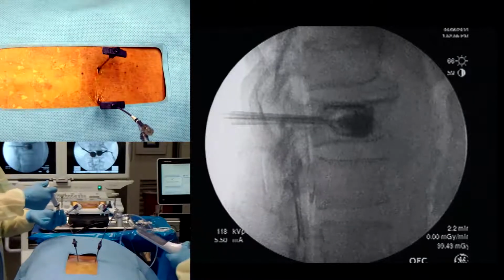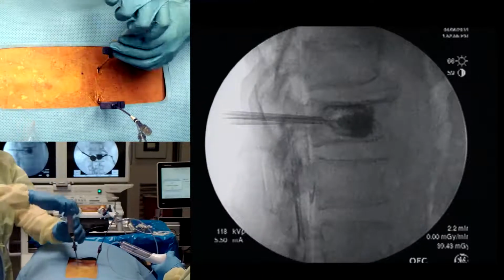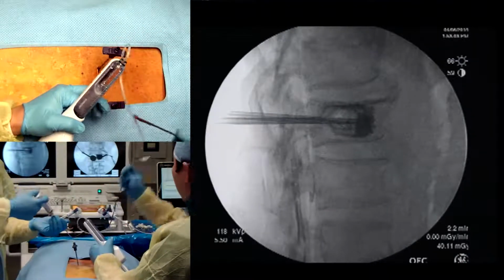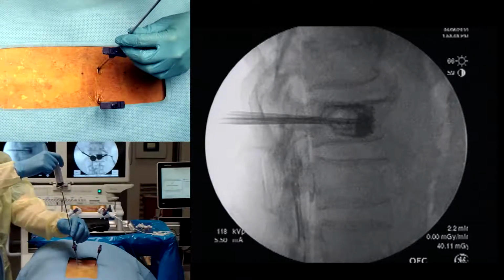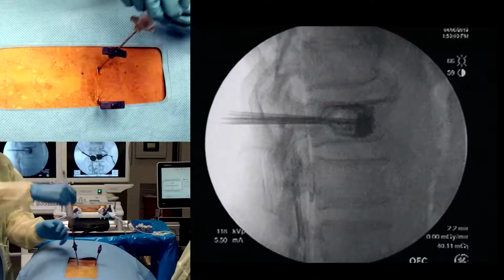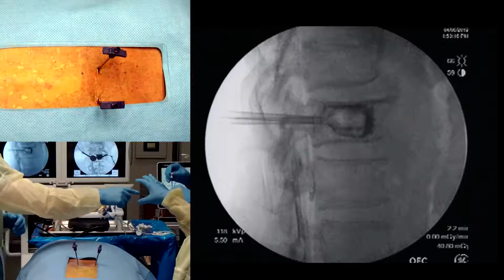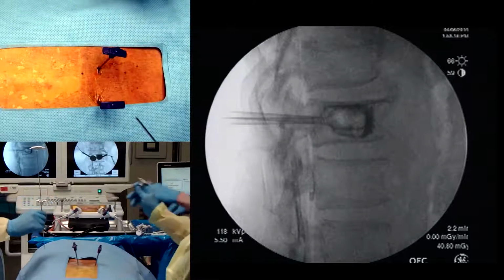It just takes a little while, right? Picture? There we go. Okay, there you go. Maybe one more time. Are you just sucking it out? Yeah. Picture that? Okay. So you can see the cavities that we've created. Normally you wouldn't see this picture, but because of the fact that there's actually some dye there, it gives us a shadow of where we were.